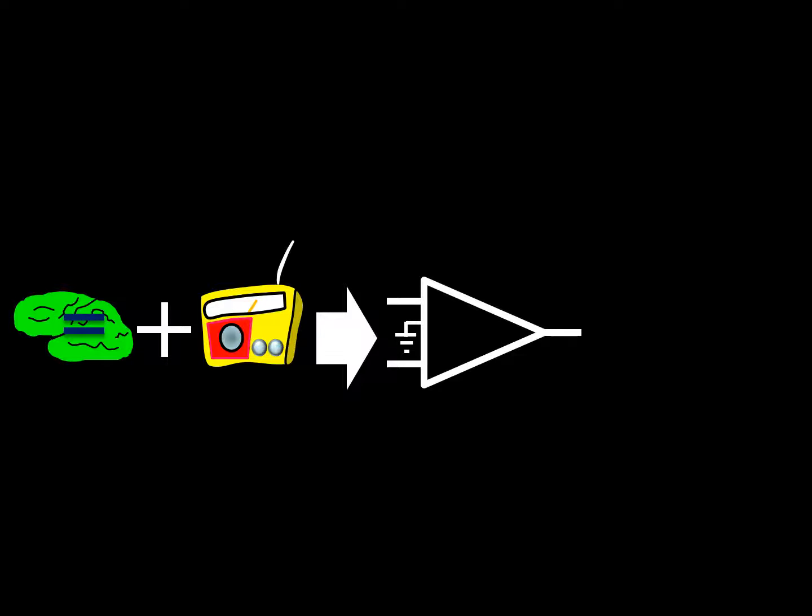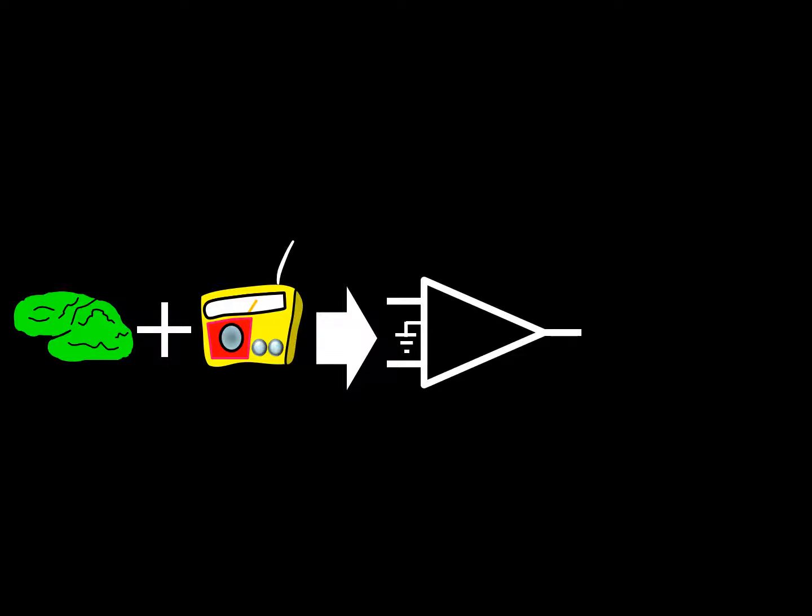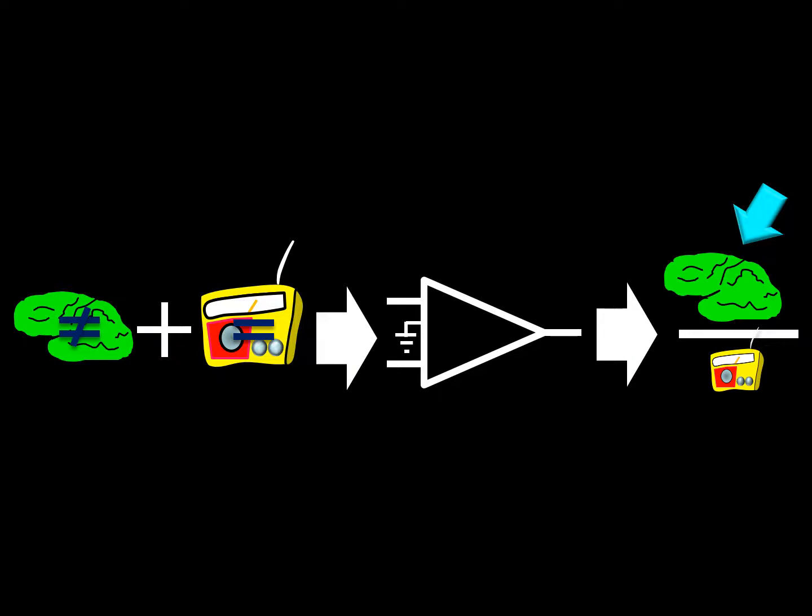Thus, in a situation where brain activity is equal and the noise is not equal under two recording electrodes connected to one differential amplifier, the epoch so recorded will be full of noise and the amount of cerebral electrical information will be very little. Such an epoch is obviously bad for interpretation. On the other hand, if the brain activity is different and the noise is the same under the two recording electrodes connected to a differential amplifier, the EEG epoch will consist primarily of brain activity and little noise. Such an epoch is good for interpretation.